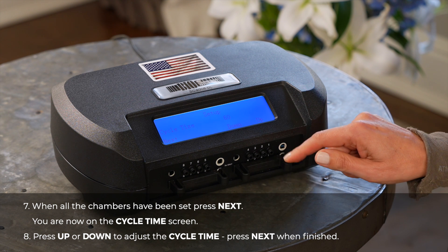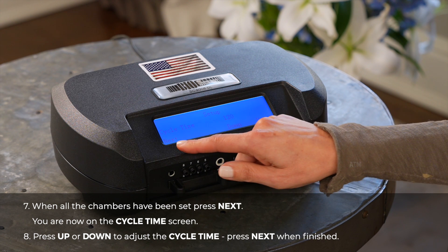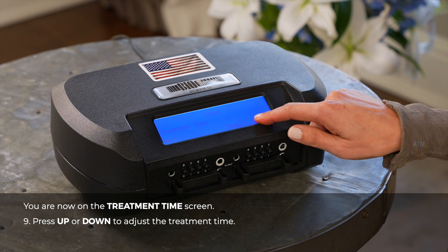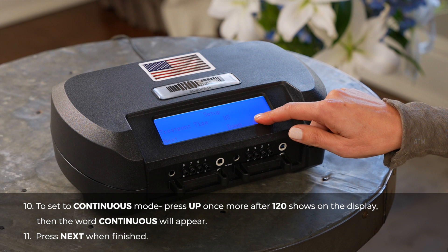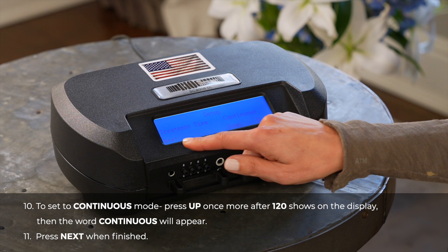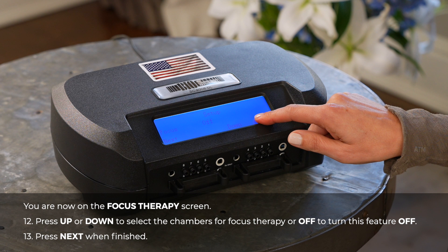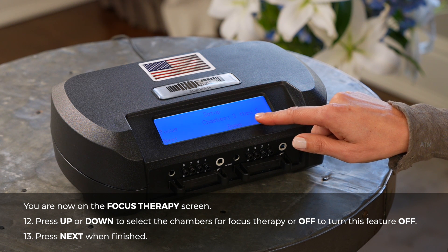You are now on the cycle time screen. Press up or down to adjust the cycle time. Press next when finished. You are now on the treatment time screen. Press up or down to adjust the treatment time. To set to continuous mode, press up once more after 120 shows on the display, then the word continuous will appear. Press next when finished. You are now on the focus therapy screen. Press up or down to select the chambers for focus therapy, or off to turn this feature off. Press next when finished.